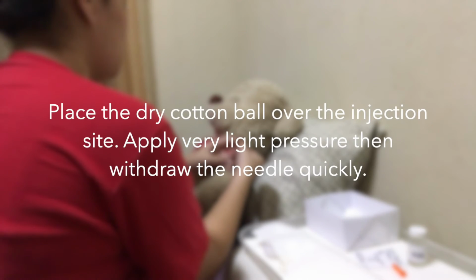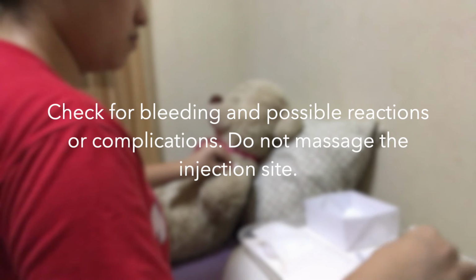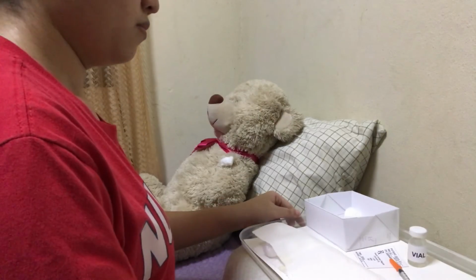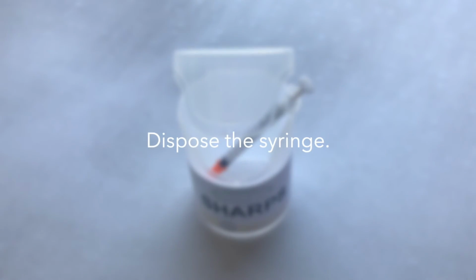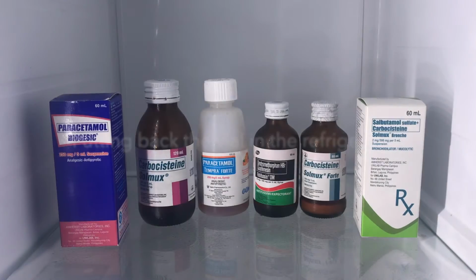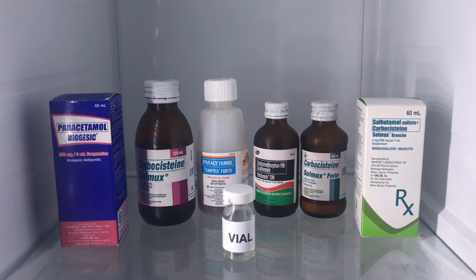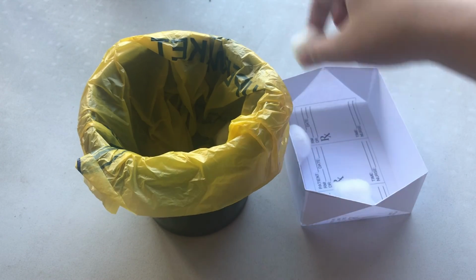Next is to place the dry cotton ball over the injection site, apply very light pressure, then withdraw the needle quickly. Then, you need to check for bleeding and possible reactions or complications. Do not massage the injection site. After which, you can do aftercare by disposing of the syringe in its respective receptacle, putting back the vial in the refrigerator at a temperature depending on its package instructions, and disposing of materials that need to be disposed of.